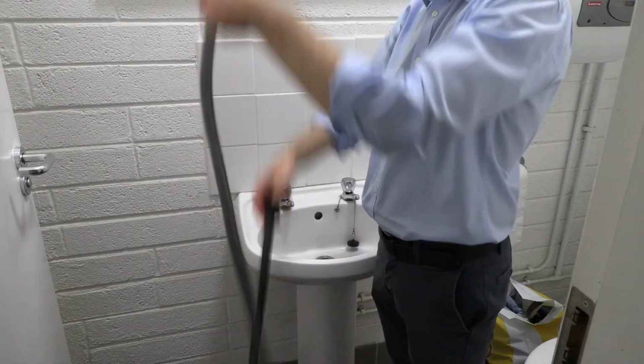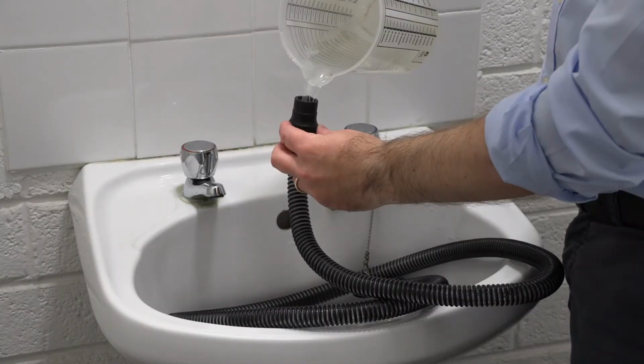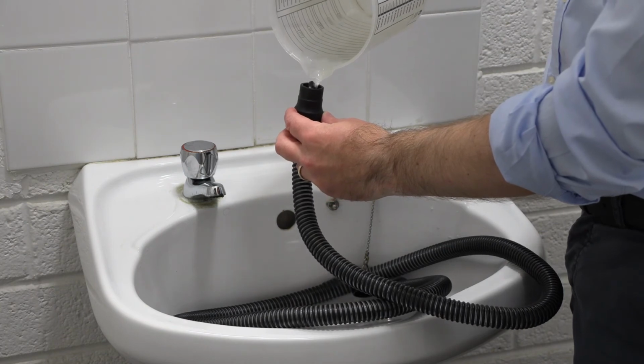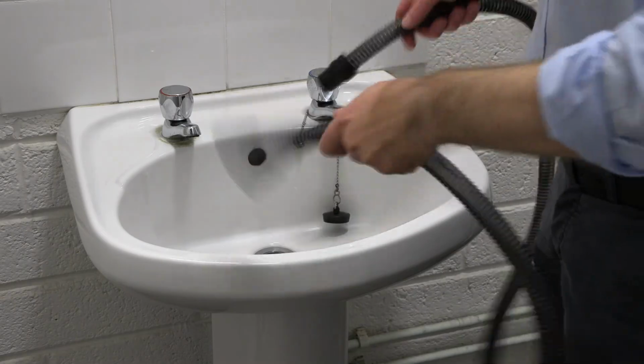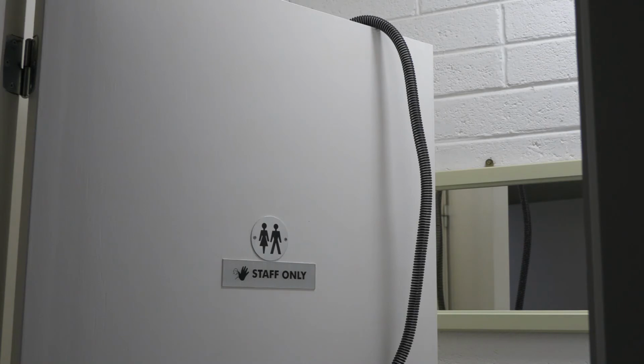Plug both ends of the tube with your thumbs and rinse the soapy water back and forth. Then rinse through with cold water and leave over a door with a towel underneath to allow it to drip dry. Please make sure that it's as dry as possible before you use it again. The best way to do this is to clean it in the morning time or at a time when you know you have at least 6 hours before you'll need to use it again.